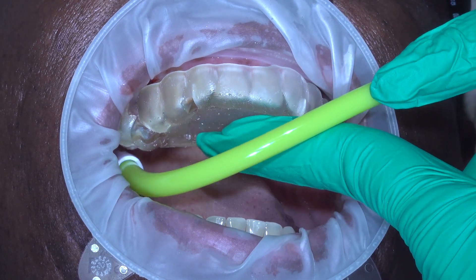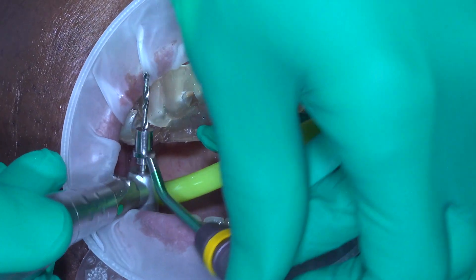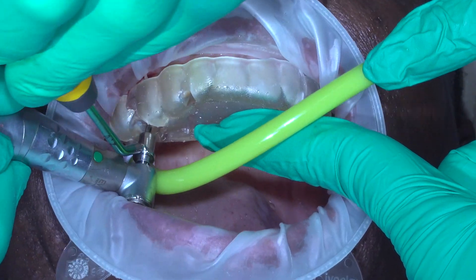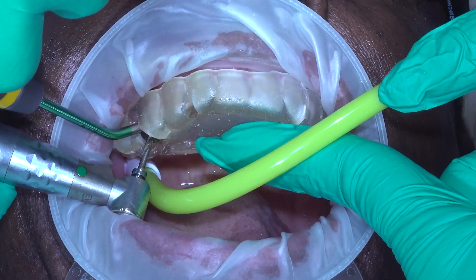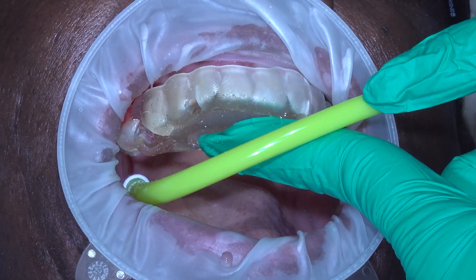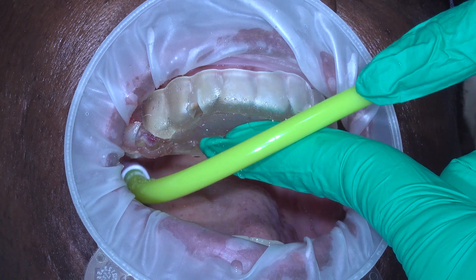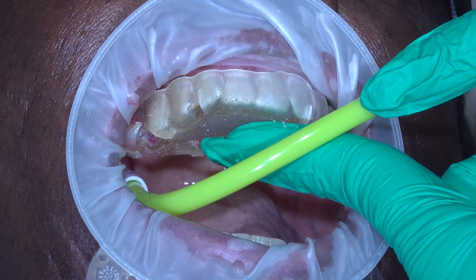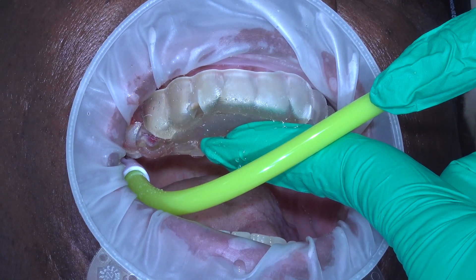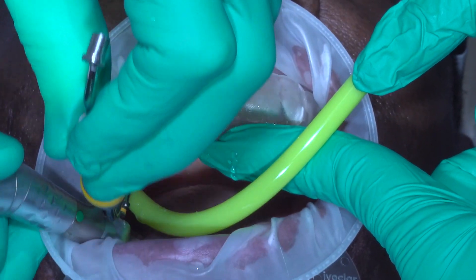This is a BioHorizons implant placement system. This particular one is the KEED system that uses same-length drills the whole time, but different diameters. They're color-coded, so this is a green case. That was a 2-0 drill. Notice how quick we go in and out with the drills — you will always want to endeavor to be very fast with your drills. Get in, get out. Once the drill is to length, there's nothing else for you to do in there but heat up the bone, and you don't want to do that.